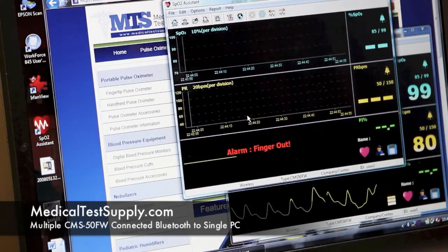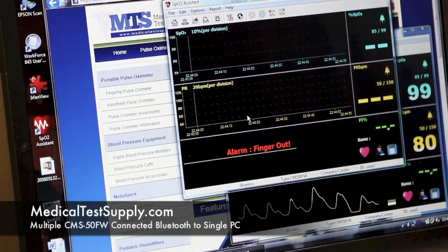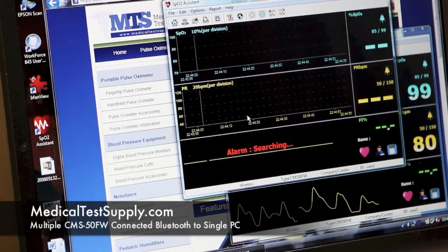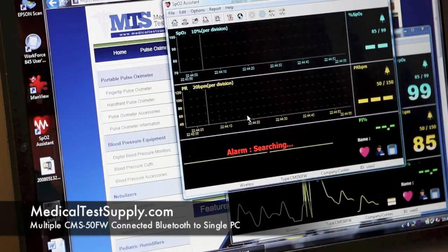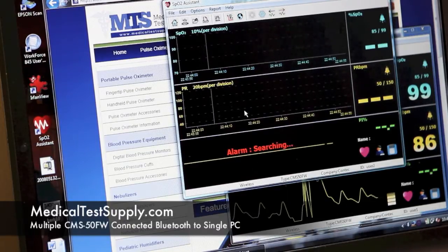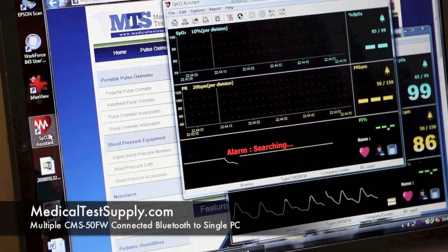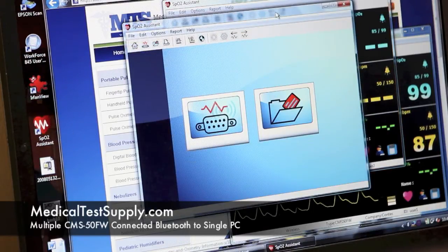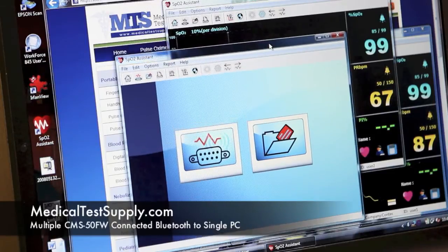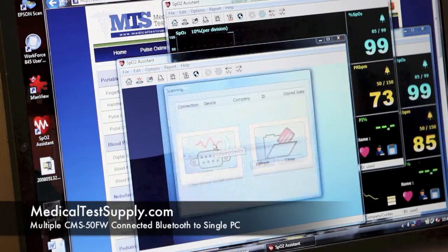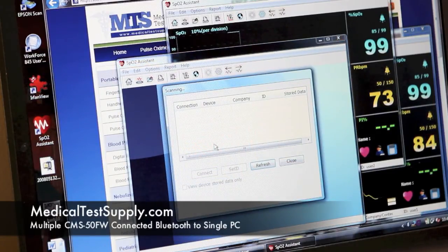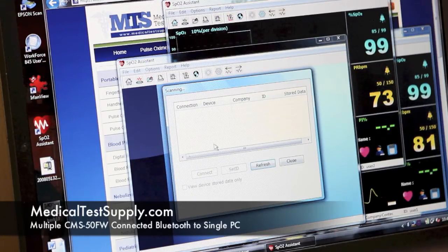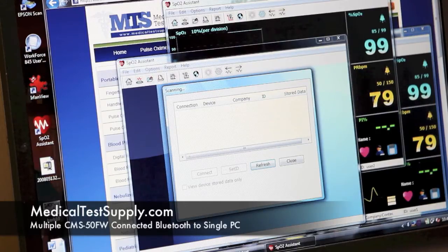First thing you'll see is finger out. We'll slide that on there and we'll start gathering data on user 2 while I start up a third instance. I'm just going to slide it down and ask it to scan for Bluetooth devices again. You can see we've got the second user's data now.